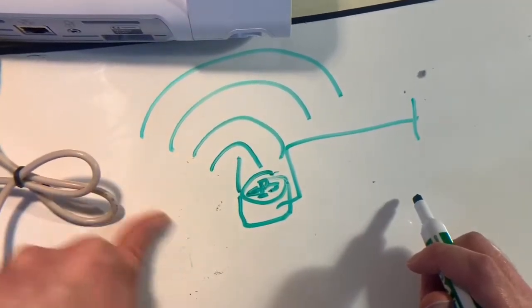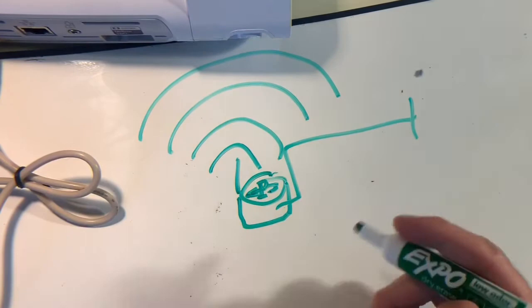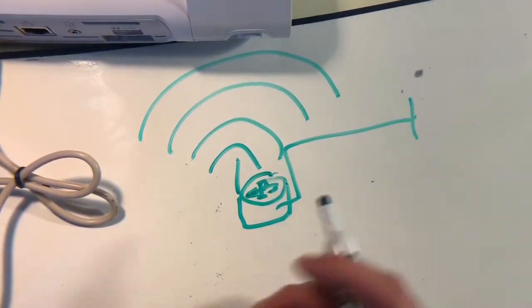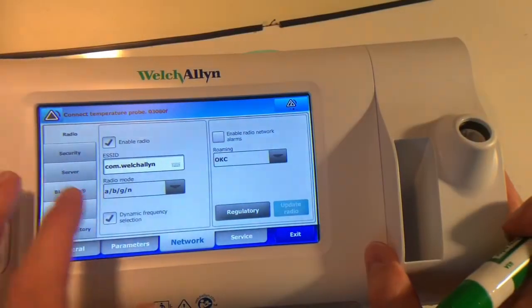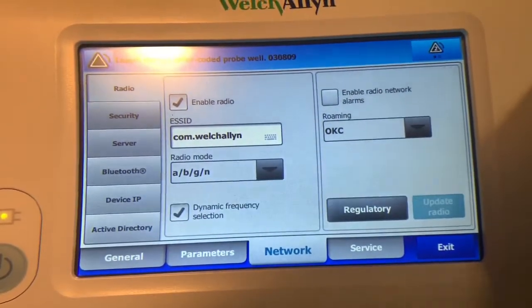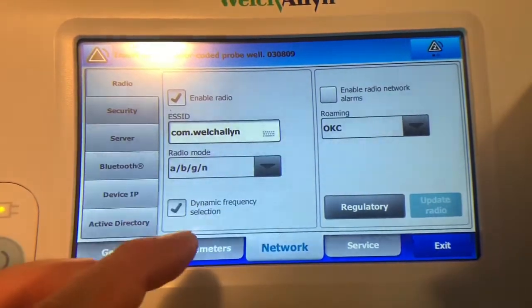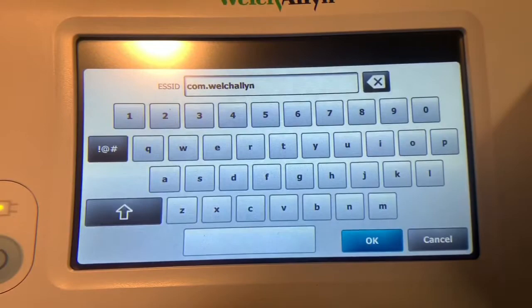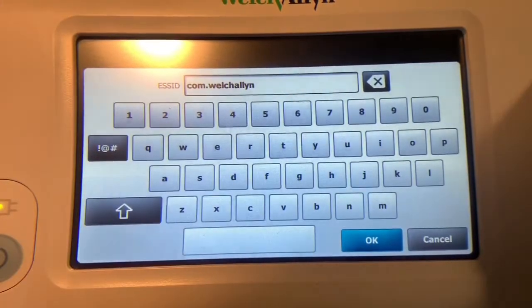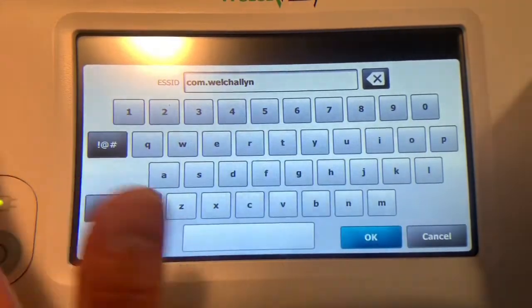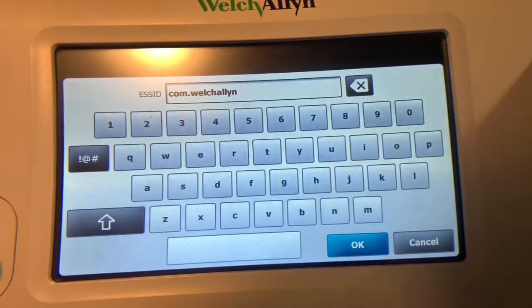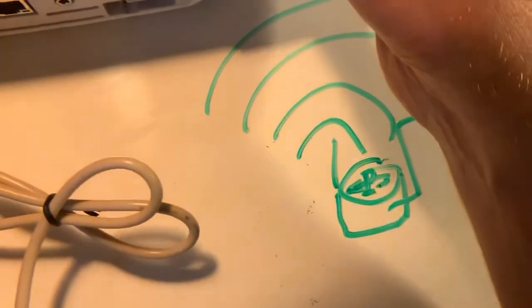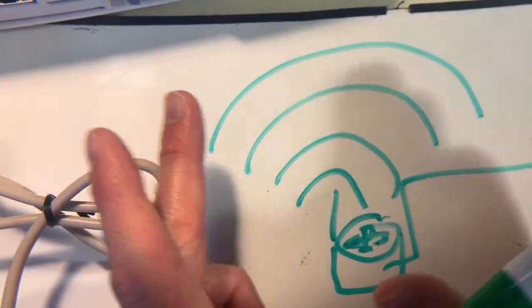With every WiFi network there is going to be a network name, and in this case that's what we want to enter in on the Welch Allyn. The Welch Allyn is not going to be able to detect wireless access points automatically. It doesn't show you a listing. Like if you had your phone and you're trying to connect to WiFi, it would show you a list of all the different networks. That doesn't do that. What you'd have to do instead is enter in what's called the ESSID, which essentially is the network name that this router is putting out.